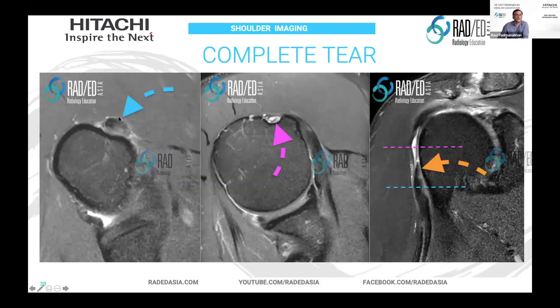Here we've got a different patient. So we're low down — here's the tendon. It's enlarged with tendinosis, it's hyperintense but an intermediate signal. Coming a bit more proximally, we have an empty tendon sheath. And here you can see two areas: the blue shows where the residual tendon is — this is the stump — and this is the portion where the tendon is missing. So we've got an absent tendon here. It hasn't retracted all that much, just a small amount, but we've got an empty tendon sheath in keeping with a rupture.